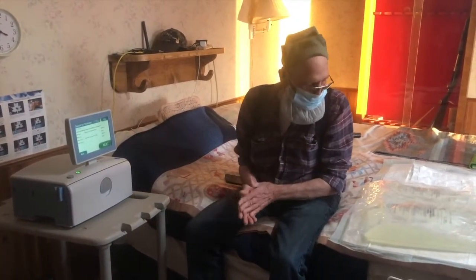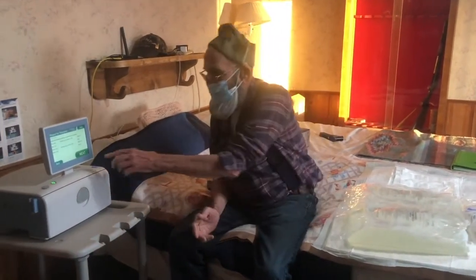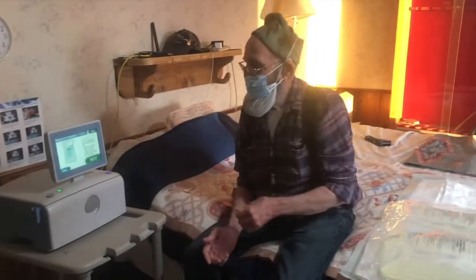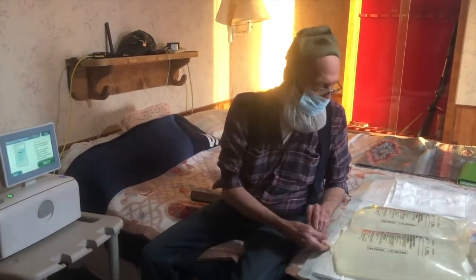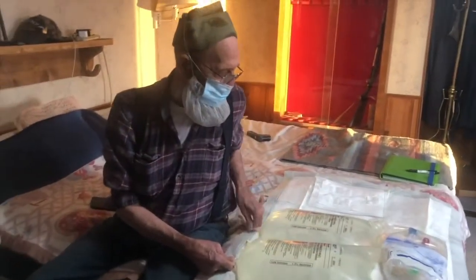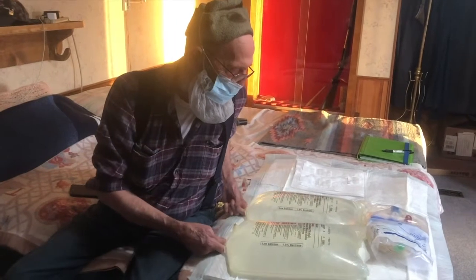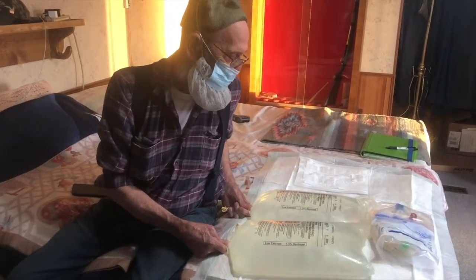My treatment solutions are bags that are 6,000 milliliters. Remove bags from packaging. Lay bags on the table. Make sure no bag leaks, lines are capped, bags are clear and leak-free, and the expiration date is not expired. November 23. Do not stack bags.